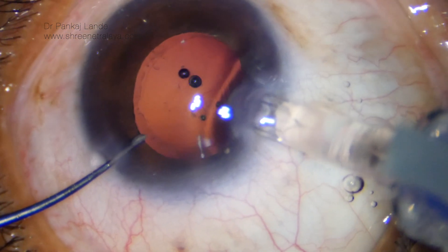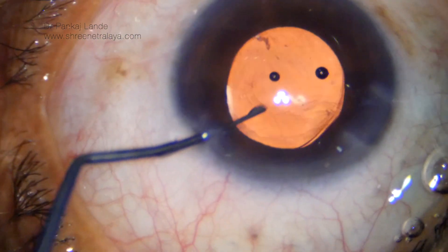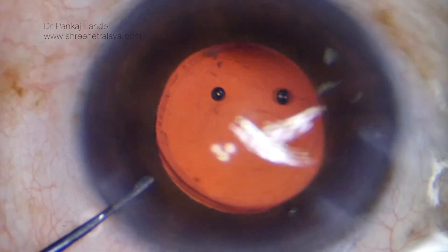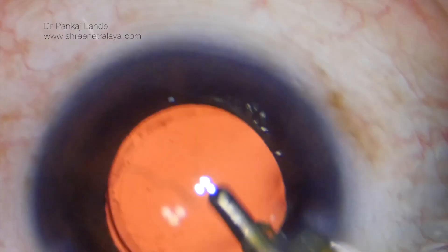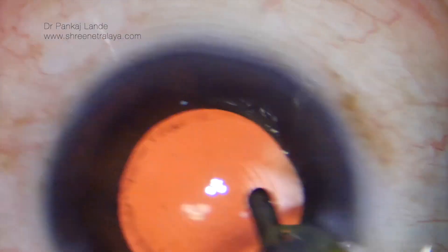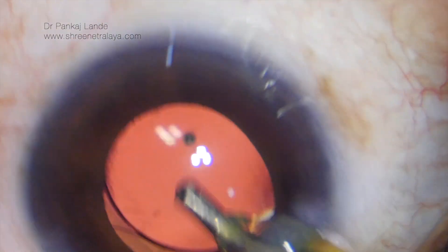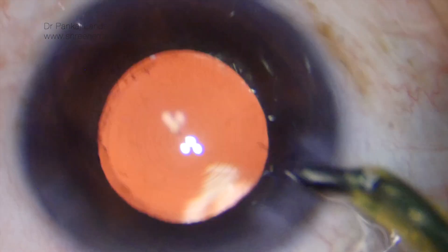This case had pseudo-exfoliation so it is important to perform capsule polishing to prevent any phimosis at a later date. This is followed by injection of a plate haptic trifocal IOL from Zeiss. Once the leading haptic is in, the second haptic is directly dialed into the bag with the left hand. The AC and the bag are then cleared of viscoelastic with maximum vacuum, and the viscoelastic behind the IOL is also removed.